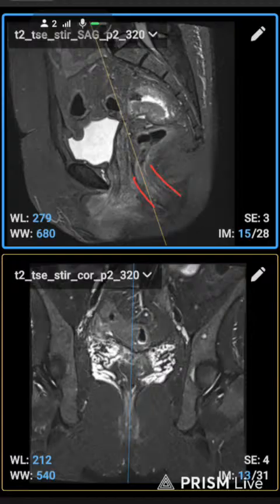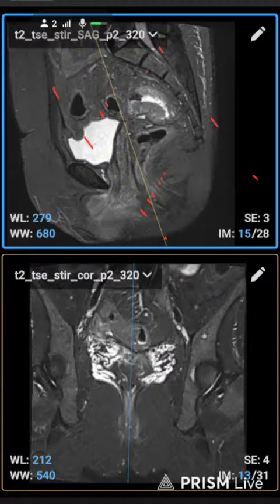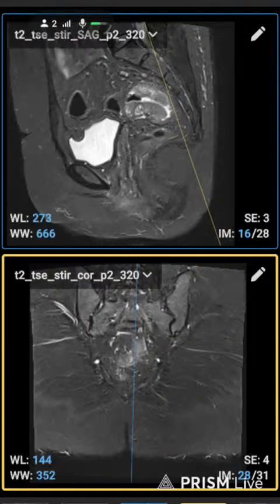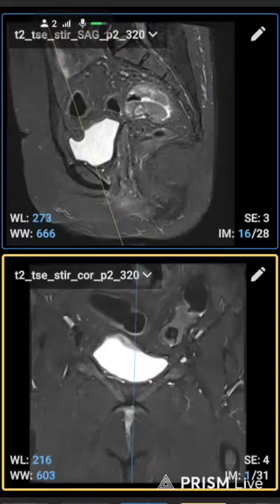So if there is advice of CEMRI rectum or sigmoid growth, we just take a coronal slice of the rectum and we include everything, like if there is a lesion in the colon, it starts from the coccyx to the end of the rectum.